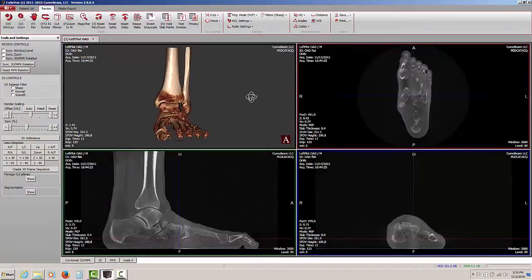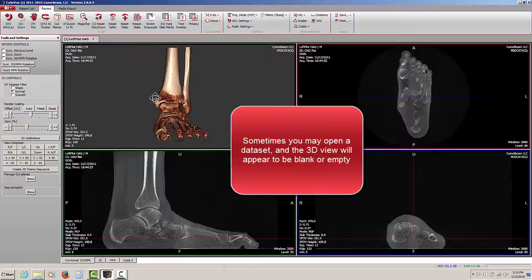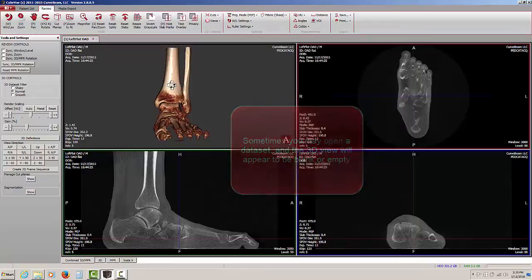Let's take a look at a different patient now. Sometimes you may open up a dataset and you may not be able to see anything in the 3D rendering window. Let's take a look at that example.